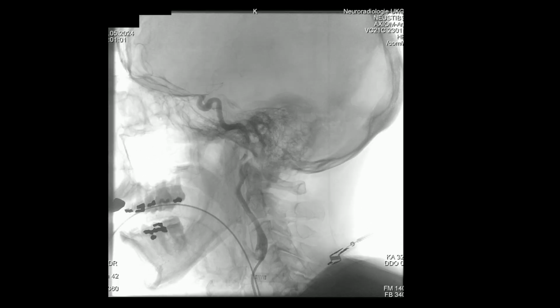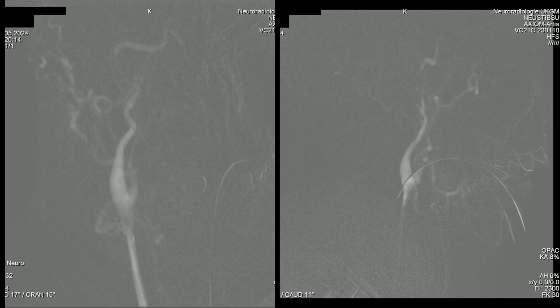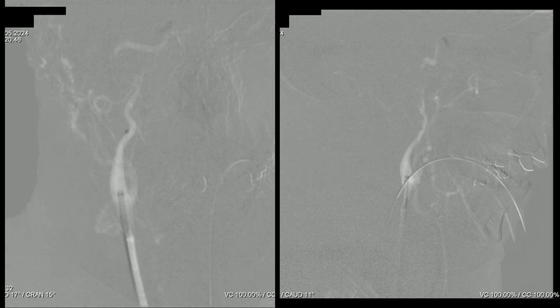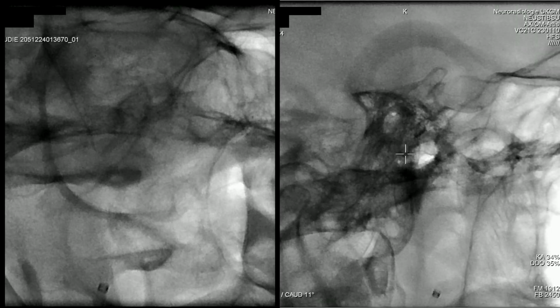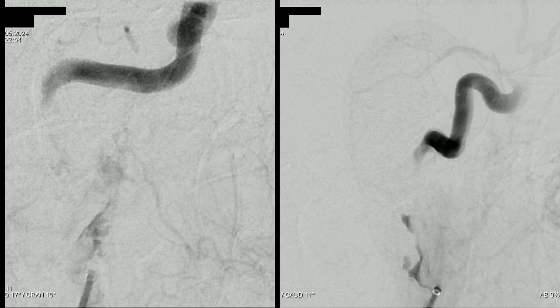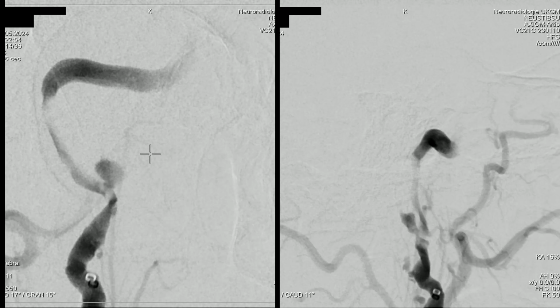And now we take our working position based on the 3D angiogram and perform a roadmap which will help us push the Neuroslider 52 into the internal carotid artery followed by the long sheath NeuronMax. And now we zoom a little bit so that we can see the very narrow lumen of the ICA and take this 2D angiogram as an overlay and start the navigation.